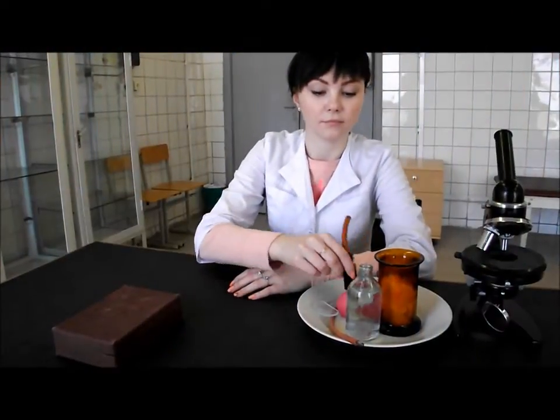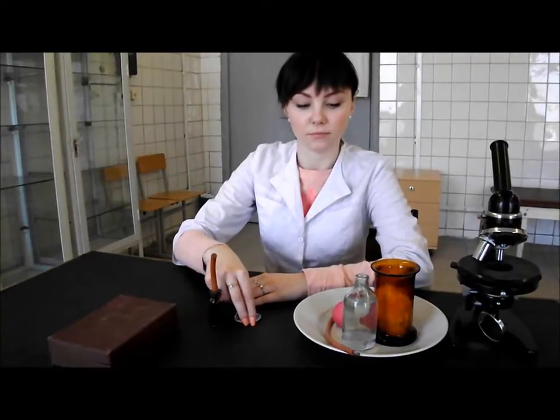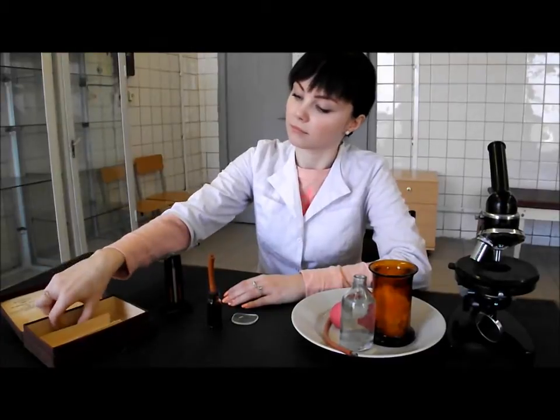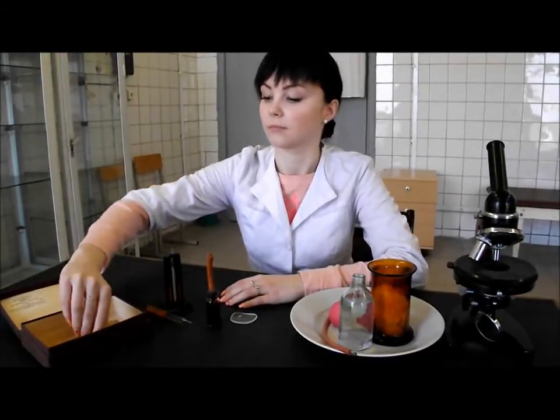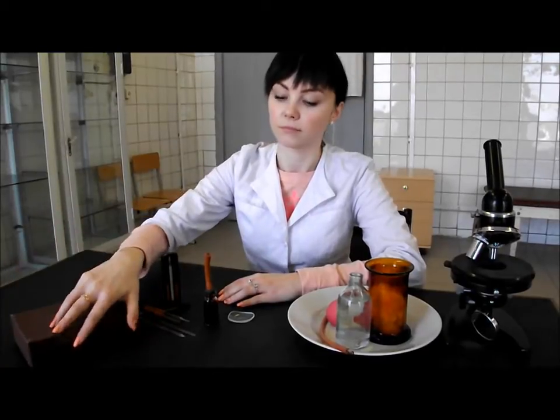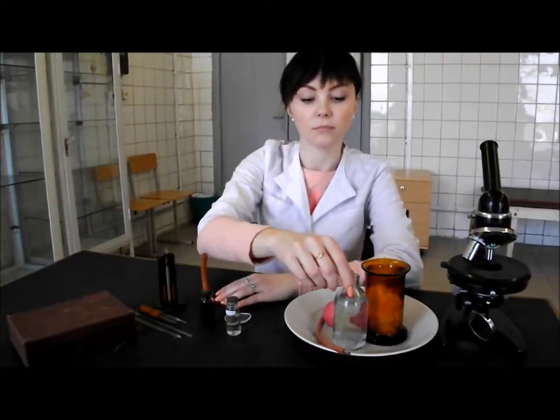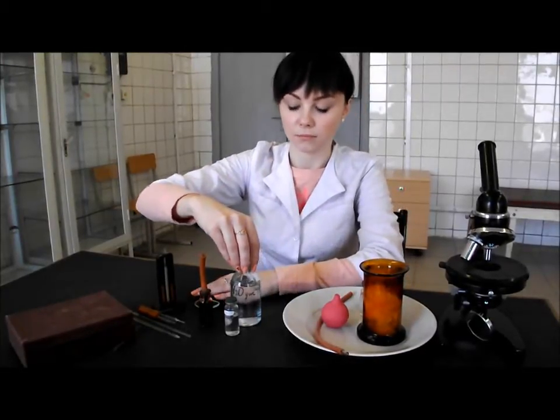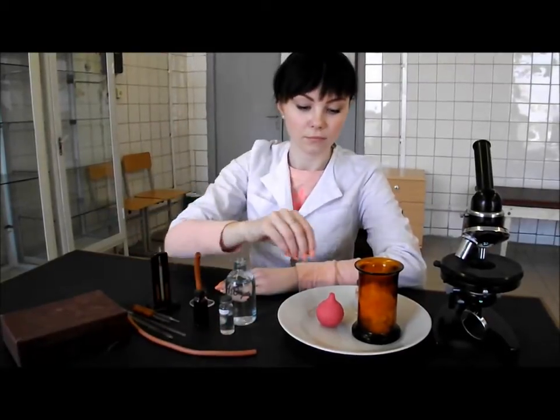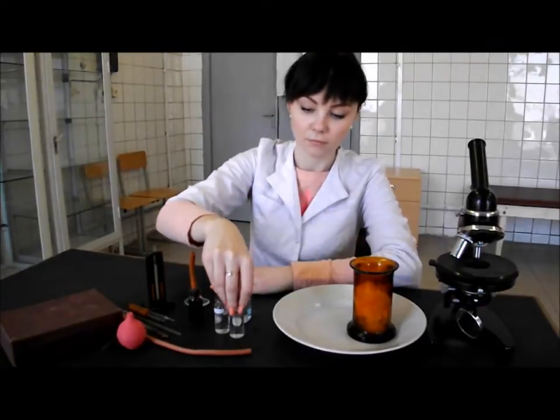For the work we need: stabilized donor blood, watch glass, hemometer of Sali, hydrochloric acid solution, distilled water, a rubber tube, a spray bulb, alcohol and cotton wool.